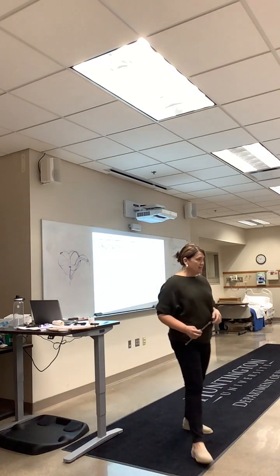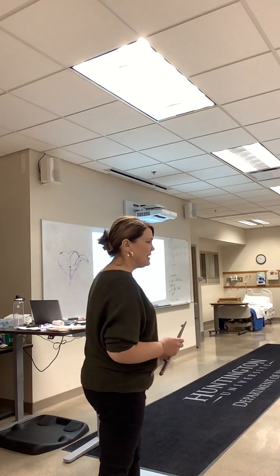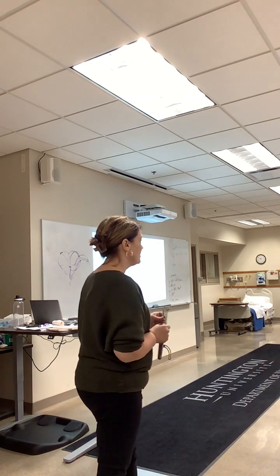How many boxes are we looking for again for the narrow QRS? I said 1.5 to 2.5. It's usually around in there. It might be 1 to 2 boxes. I'm not measuring real exact, but yes, 1.5 to 2.5 boxes.